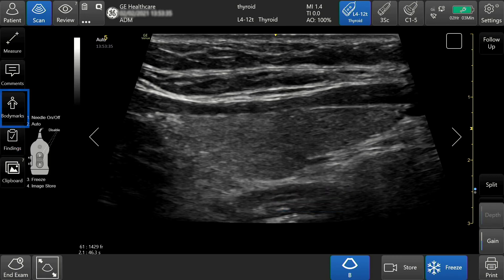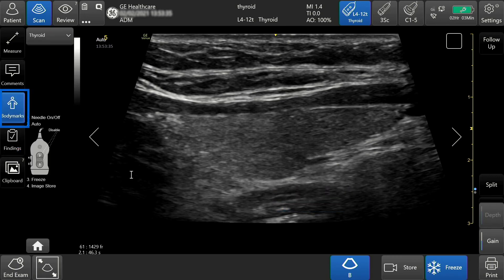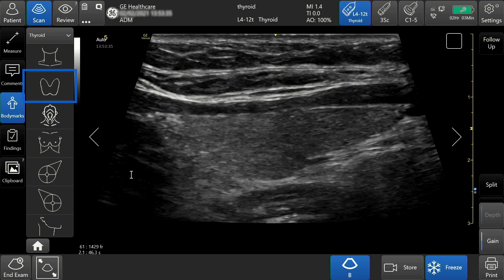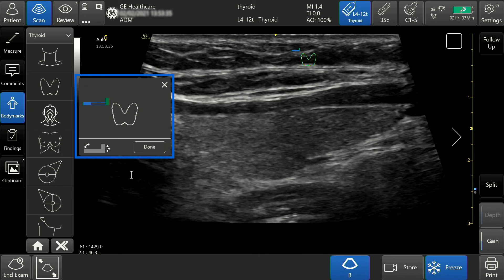Tap body mark to add an icon to your image. Select the desired body mark. A large image will appear with a symbol for the probe. Position the probe symbol to indicate the scanning position.